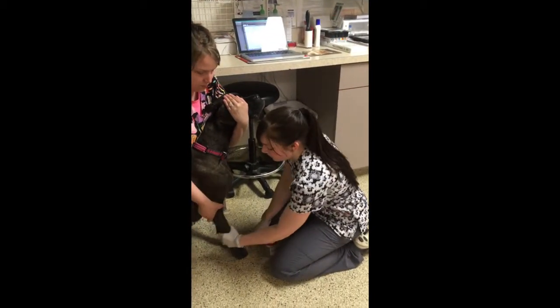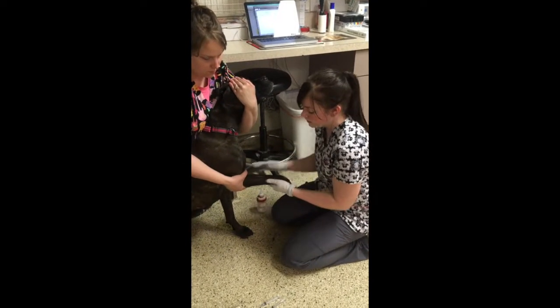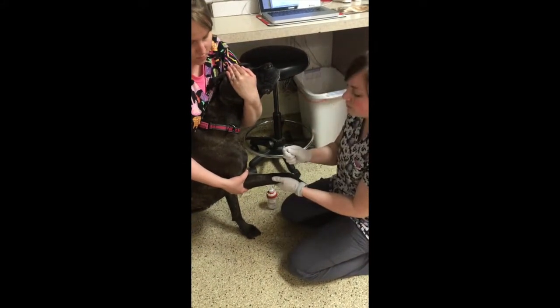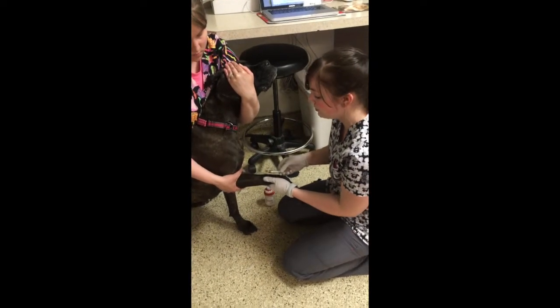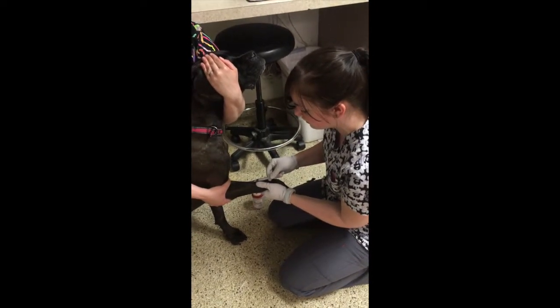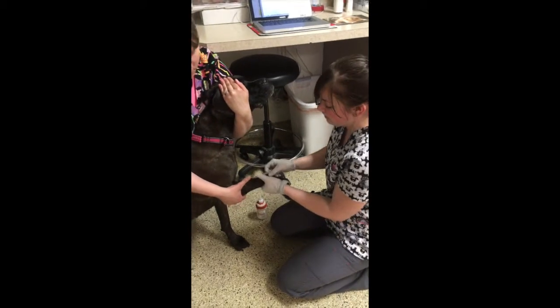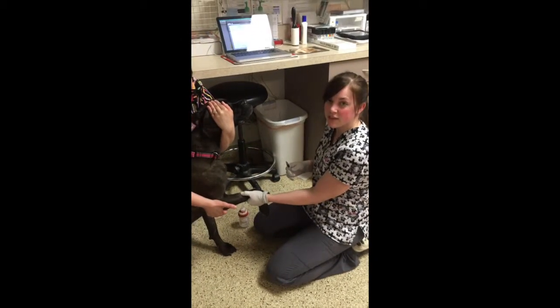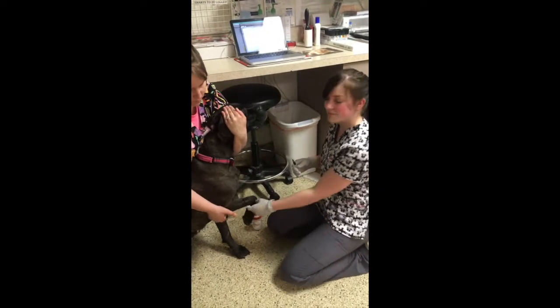So I'm going to go ahead and lift up her leg. Apply alcohol to the top of the leg. Palpate for the vein. Once I've palpated it, I'm going to remove the top off my syringe. Make sure my bevel is up and insert my needle. Once I've obtained the blood, my assistant's going to let go of the pressure, and we're going to put pressure on top of where the needle is. Hold it for a few seconds. And then we should be good.